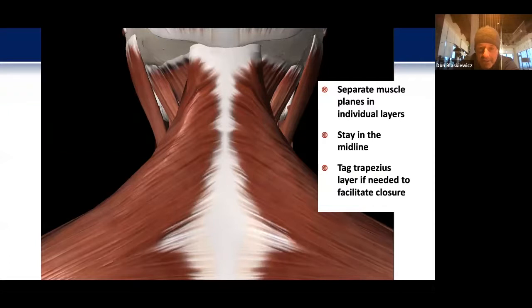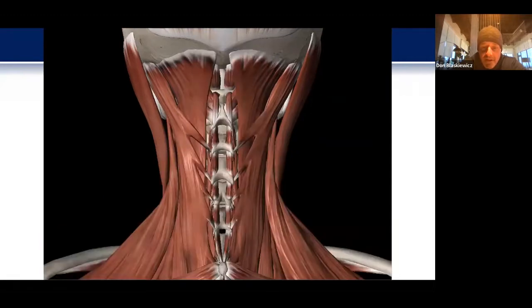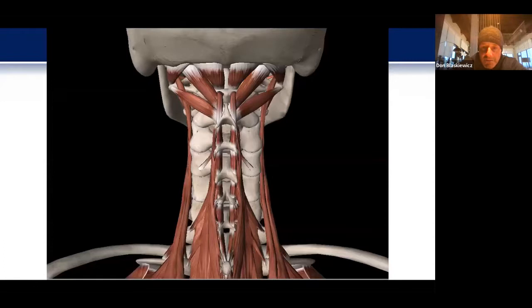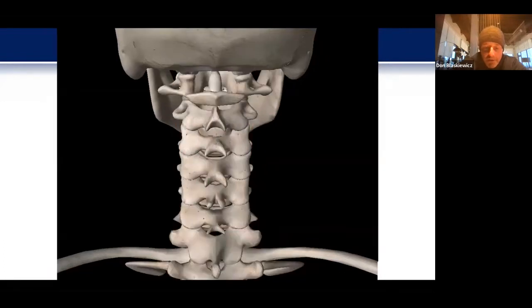Once I do the lazy S skin incision, I'll mobilize the muscle planes in serial layers, staying in the midline. If the trapezius is on the scant side, I'll tag it with silk suture so at closure I can bring it together in its own separate plane. Then I'll take off the various layers of muscle, resecting the splenius and so forth, being very mindful of hemostasis and sparing as much tissue as I can, particularly at C2 if I'm not including that in the construct.